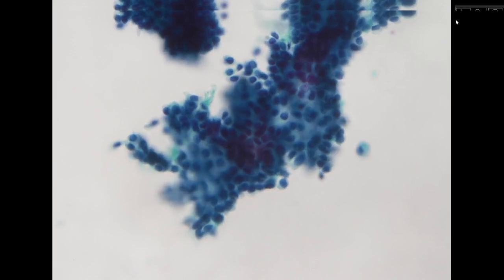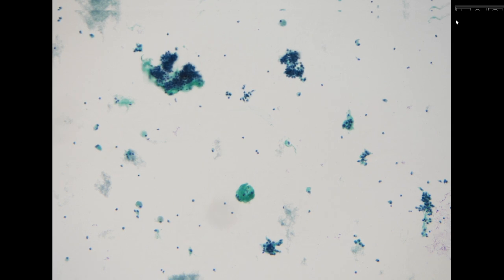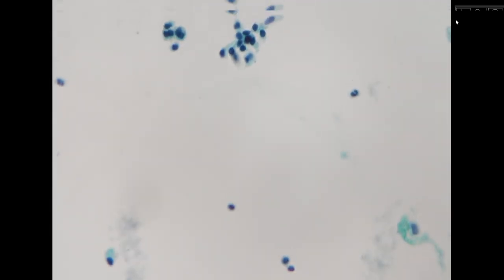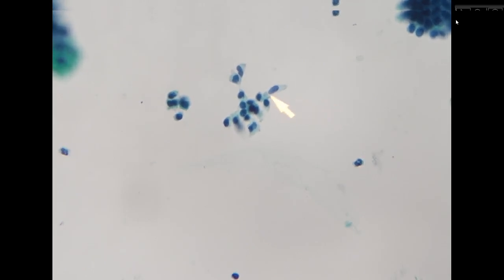Most of these cell clusters, we do appreciate, are tightly compact basaloid cells, but in some of the area, these are non-neoplastic acinar cells, so we can tell that we do have some normal parotid cellular component here. However, I think some of the cells, for example here, show much more prominent oval or spindle shapes.